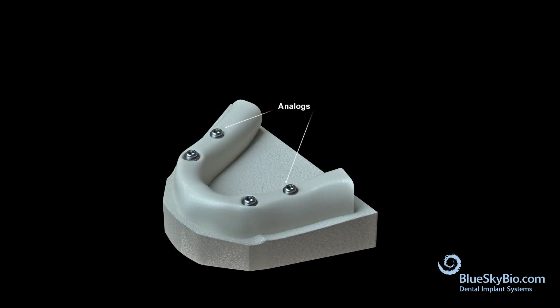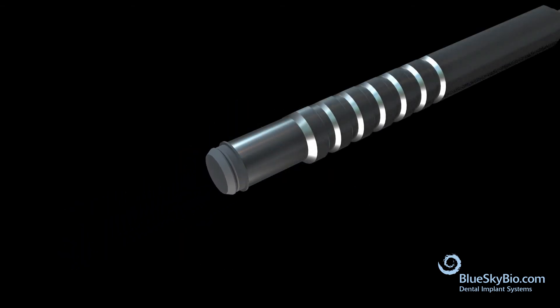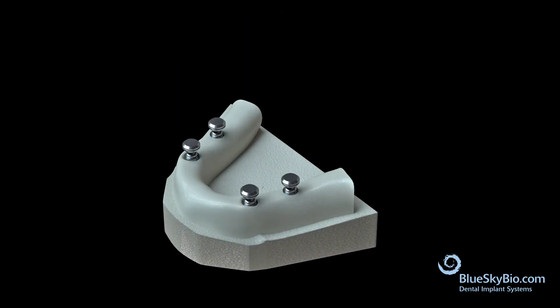Remove the stone model — the analogs will be visible. Use an insertion tool to place the black processing insert into the metal housing. Place the housings with the black inserts onto the analogs, then process the denture with the housings on the model.